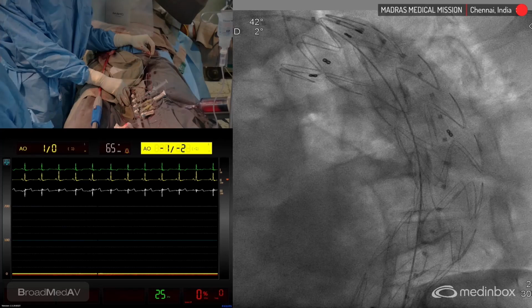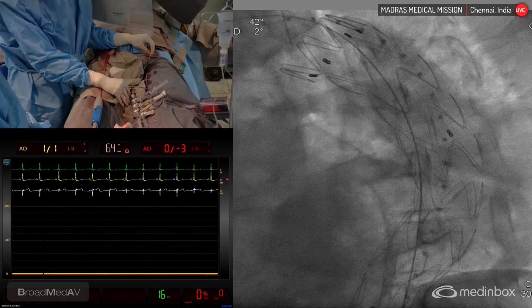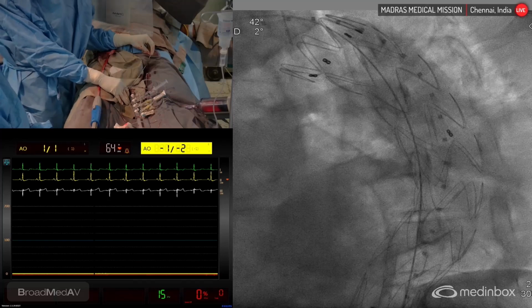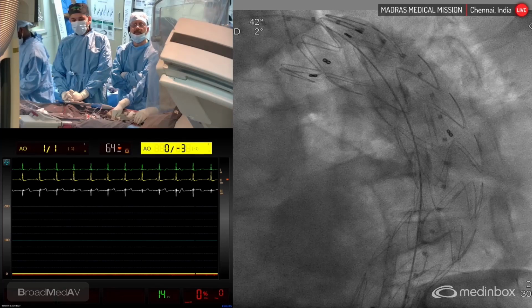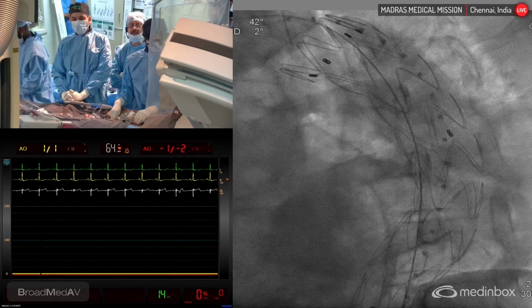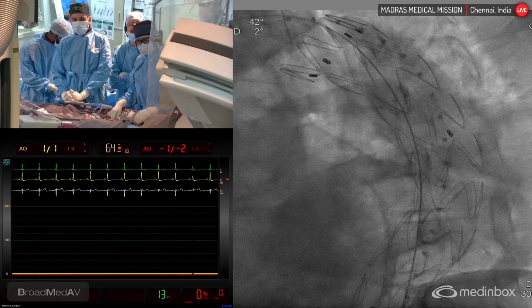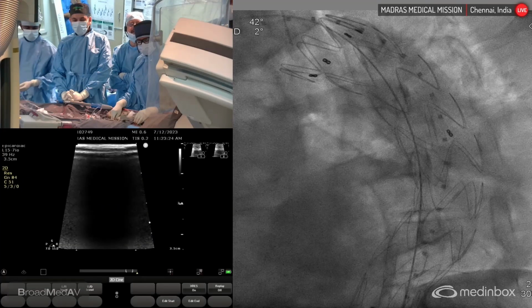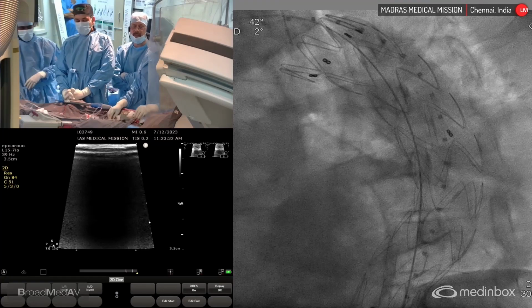The 6.5 centimeter you were saying, what measurement, sir, is it? It is a CT measurement of short-axis. We'll show you the CT images again, the CT images of the cross section. So it is a thrombosed portion and the lumen portion combined together. Since it is fully thrombosed, you are not able to make it out. Now, just show the aneurysm on this side. So, see, that is the aneurysm. Since it is thrombosed, we are not able to make out the aneurysm here.